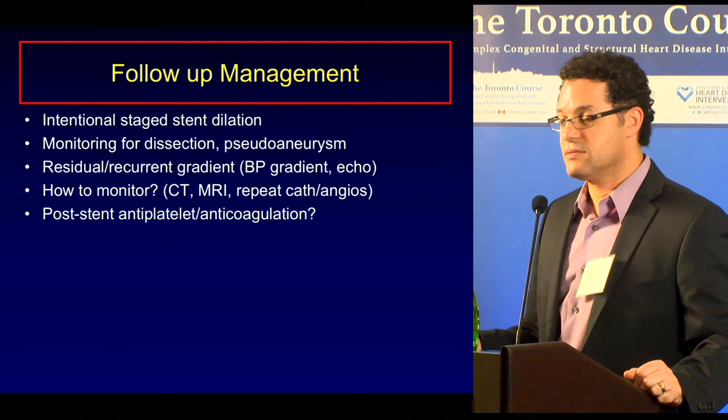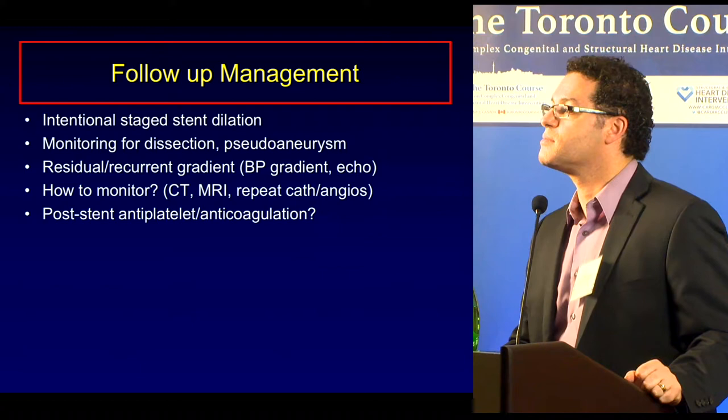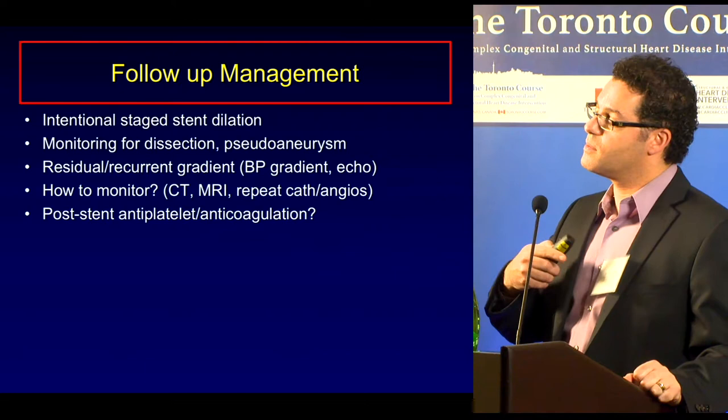Is there anyone who's ever had a clot that's formed on their stent? What's the impetus for doing the aspirin on the stent? They have enough vascular disease beyond it, usually. Just giving a coarctation patient an aspirin, it's not a big deal. So you're doing it more for their arteries, not so much because they put in a stent.